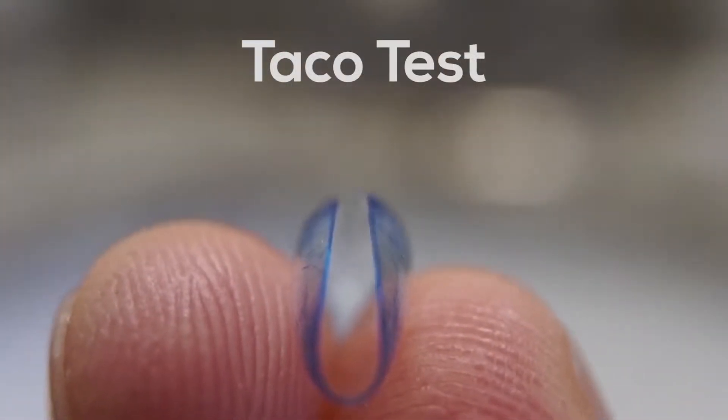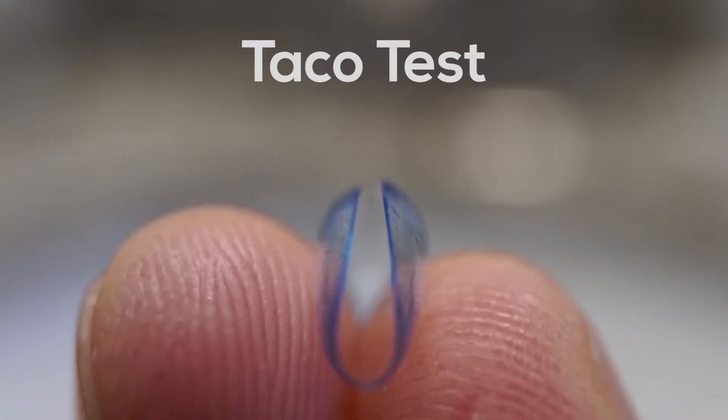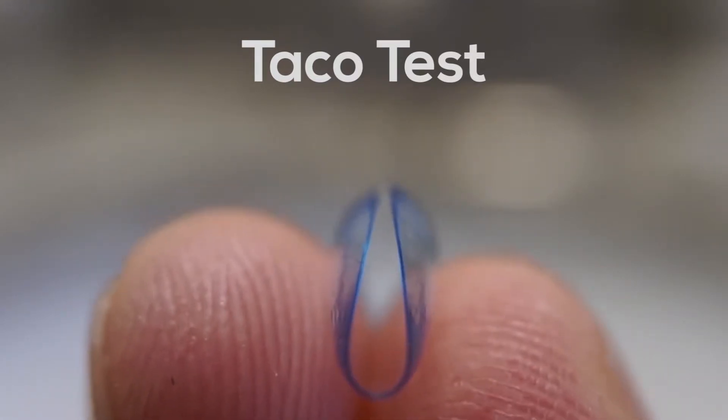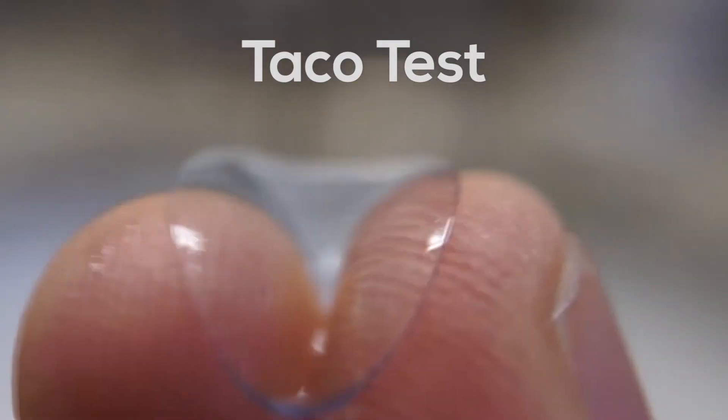Option B: Perform the taco test. Do this by putting the contact lens between your pointer finger and thumb. Next, pinch the lens together and look to see if it makes the shape of a taco. If it appears the lens is bowing out, it's inside out.